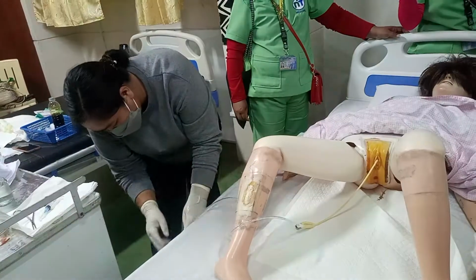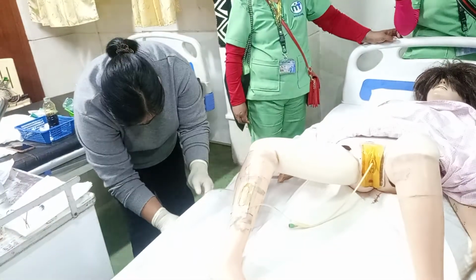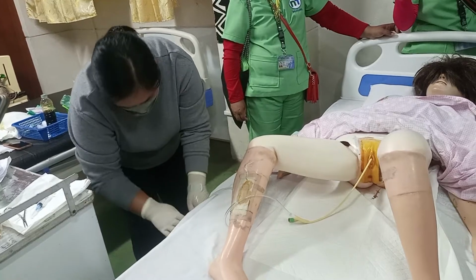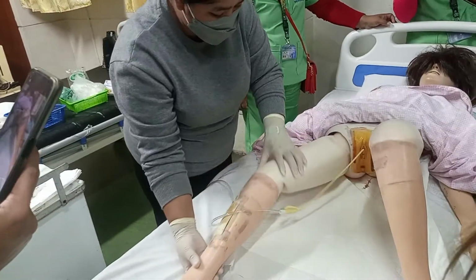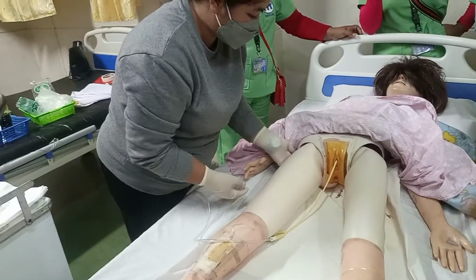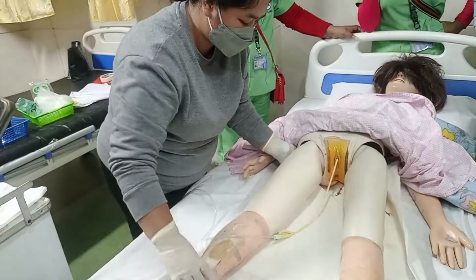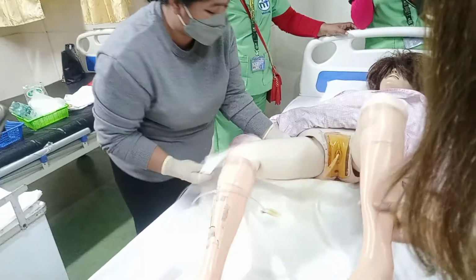Okay, in this case, kailangan natin ng may tali. Kasi wala. Alright, so there, thank you, ma'am. Okay, so there. Ay, wait lang. Ma'am, 1, 2, 3. 1, 2, 3.